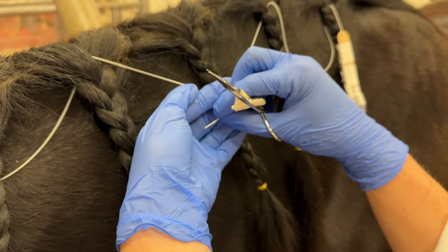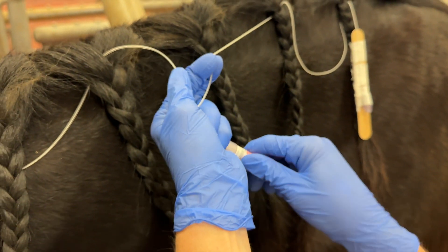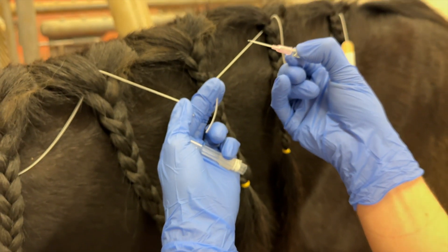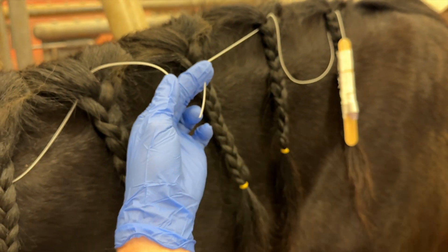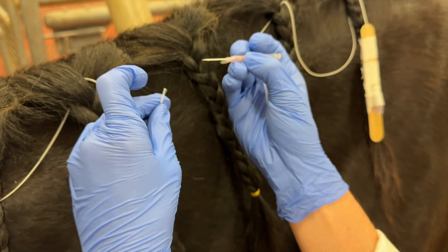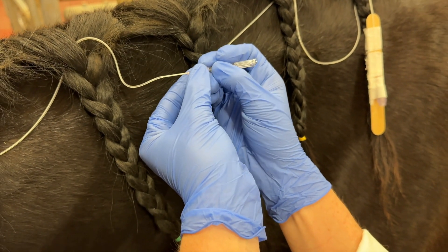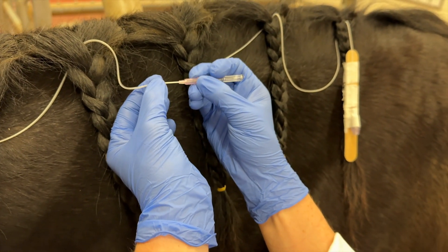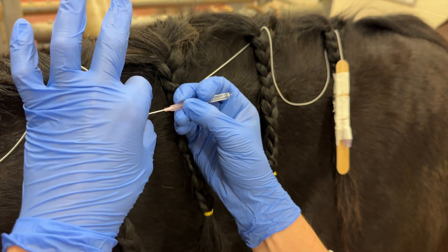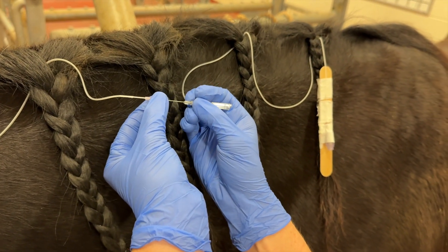All you need here is a 20 gauge catheter and some tape. The 20 gauge catheter is going to be inserted onto one side and then spliced onto the other. It does have a sharp needle at the tip, so once you place it into the line, back the needle out a little bit — but the needle does provide some rigidity to push against and slide that tubing along the catheter. Place it along the catheter at least halfway and then pull the needle out.